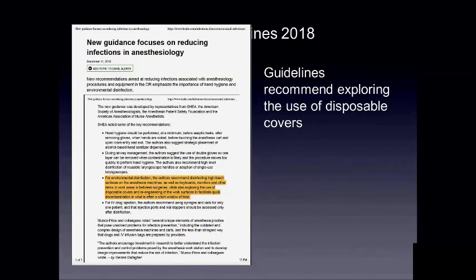For example, at another facility, the IT department became a proponent because they said, hey, we can't seem to keep replacing the touchscreen because everybody complains that the touchscreen stops working. And most of the touchscreens today are not compatible with the cavi wipes that they use to clean the monitors. So that destroys the touch sensitivity of the screen. So they are also wanting the screens to be protected, and it has come up at several hospitals where JACO has come and asked, how do you clean the touchscreen? So with the advent of EHR, we are having all kinds of opportunities present to us.